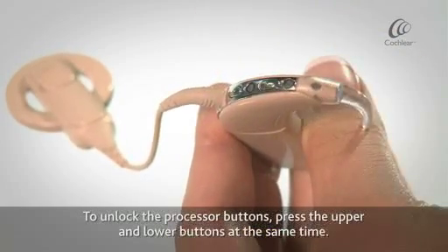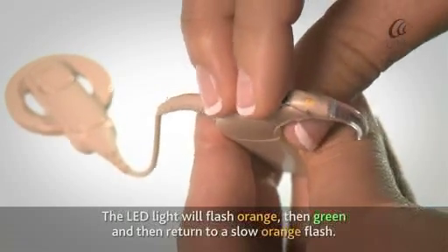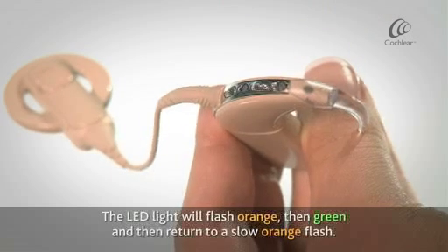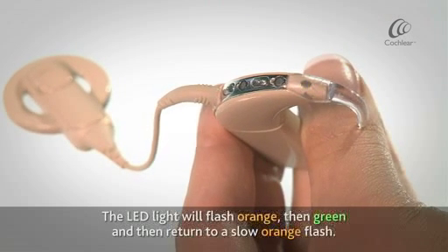To unlock the processor buttons, press the upper and lower buttons at the same time. The LED light will flash orange, then green, and then return to a slow orange flash.